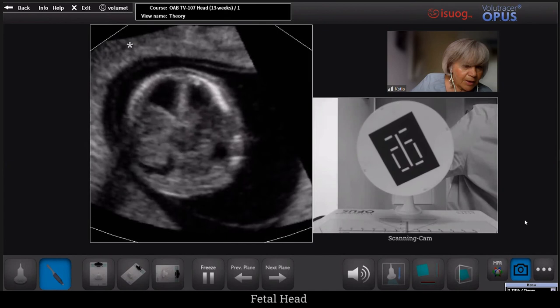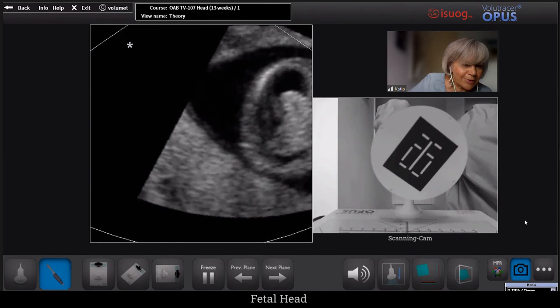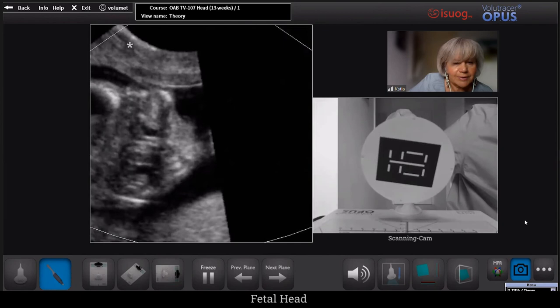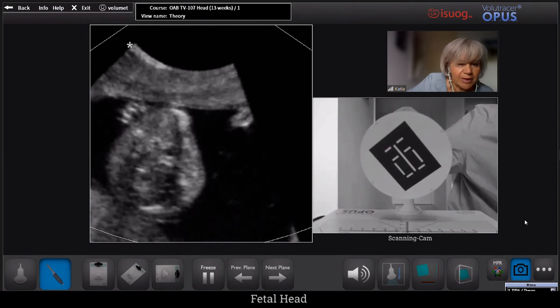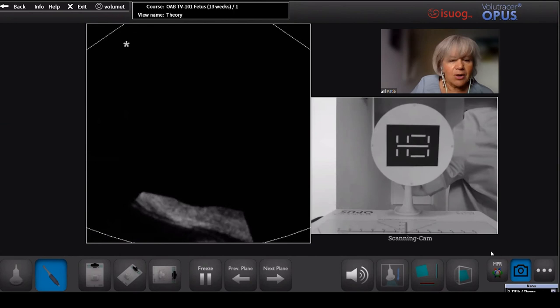By navigating through this volume, we can see the structures we want to find very easily. Pay attention to the fact that you may also be able to find other structures — like the hands, for instance. We can see here both hands: the left hand there and the right hand here.